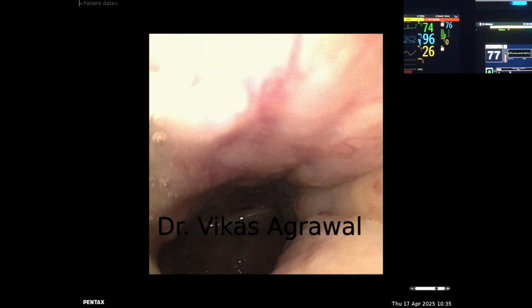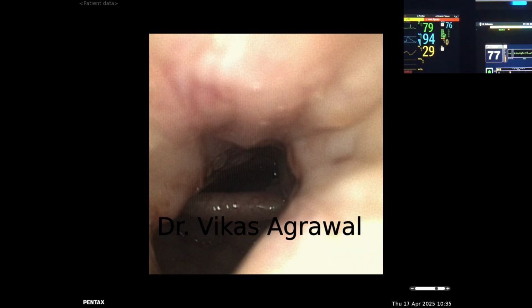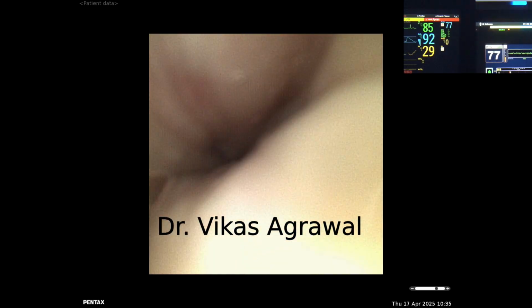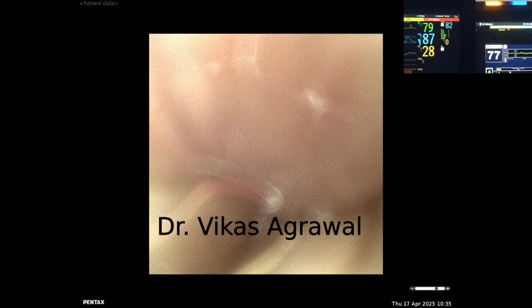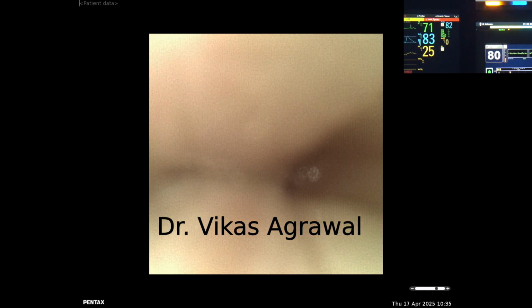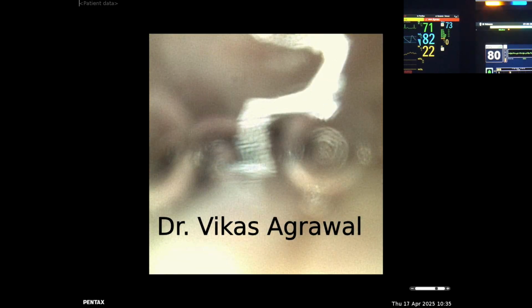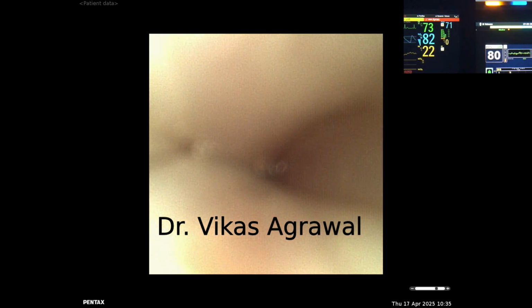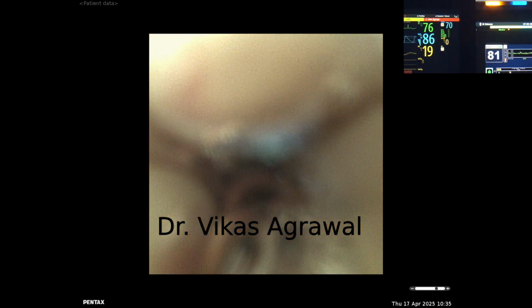On the physical examination, his tonsils were large, palate was long, and the same thing you can see here. Its palate is collapsing. Now this is in the correct range, 70s, and we can see a complete collapse of the lower part of the soft palate, which is both anteroposterior and lateral, but majority anteroposterior. You can see both AP as well as lateral.